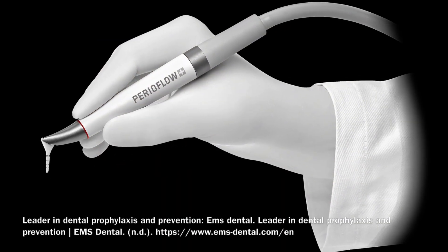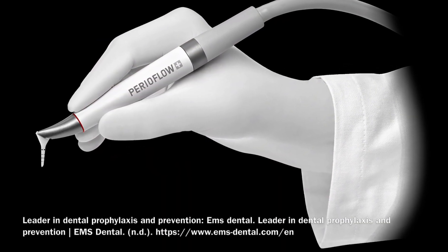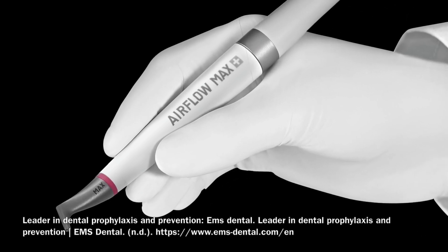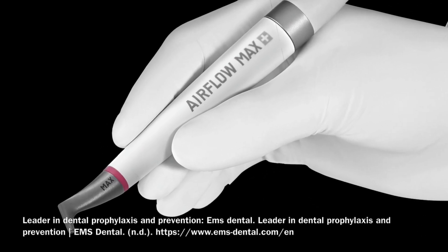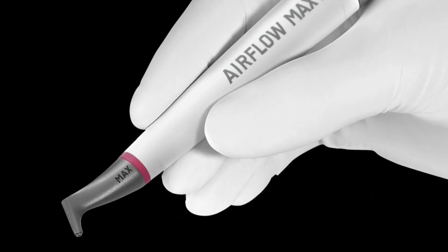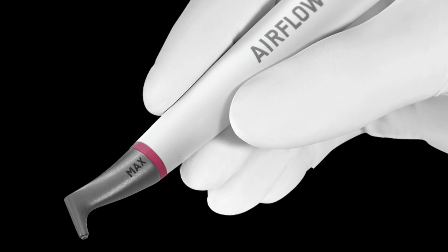For the PerioFlow handpiece, the powder velocity should range from 5 to 10 when pointed coronal to the CEJ, and 3 to 6 when pointed apical to the CEJ.